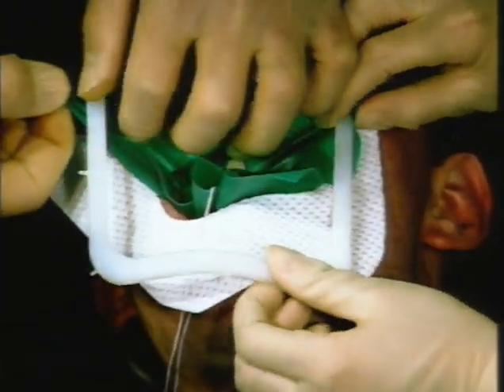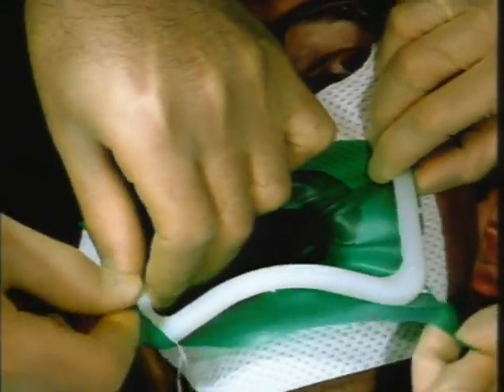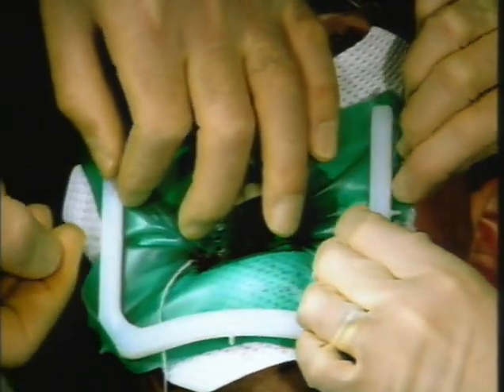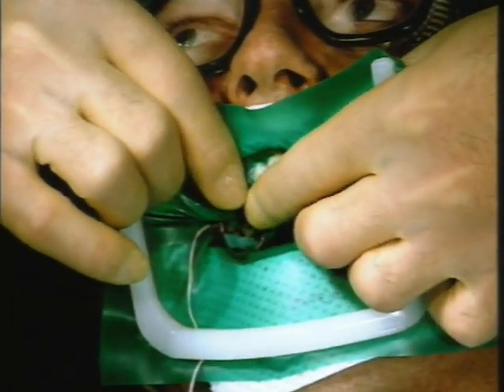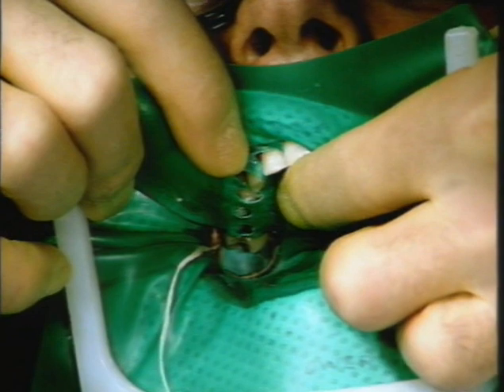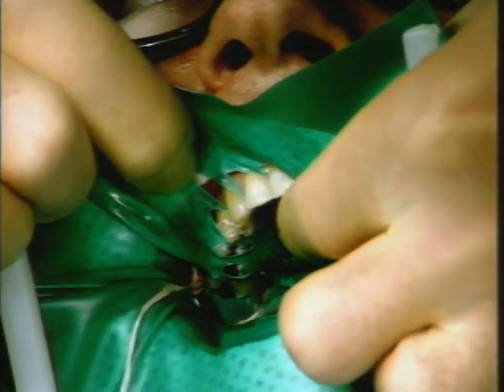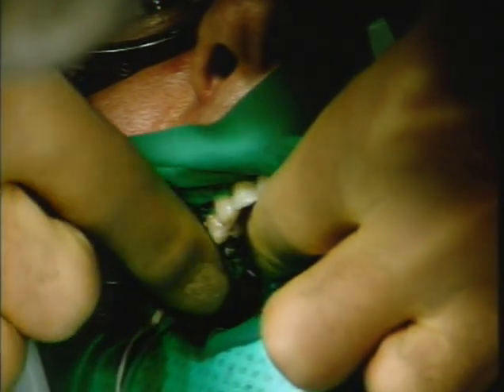And it's very helpful to have 4 hands to put the frame on. Stretch just reasonably firmly, but not too tight. Some of those remaining contacts will probably go through by just manipulating the rubber. It's where these contacts are not very tight, as we noticed between the canine and the first premolar, then a little air. That's right, you can keep blowing the air. It helps to hold the rubber dam on.